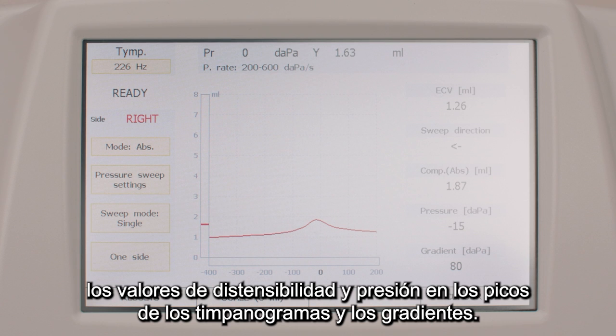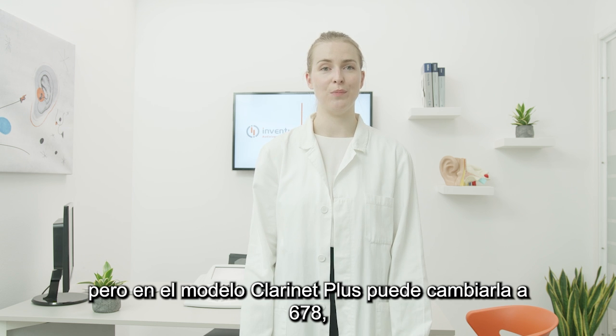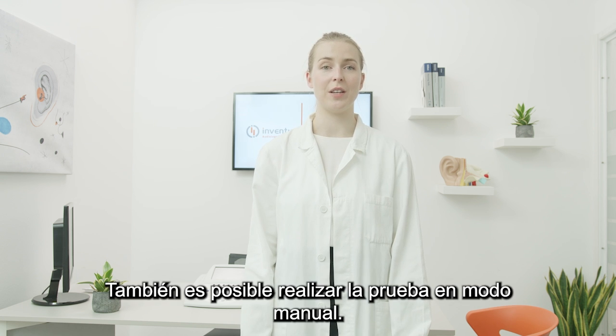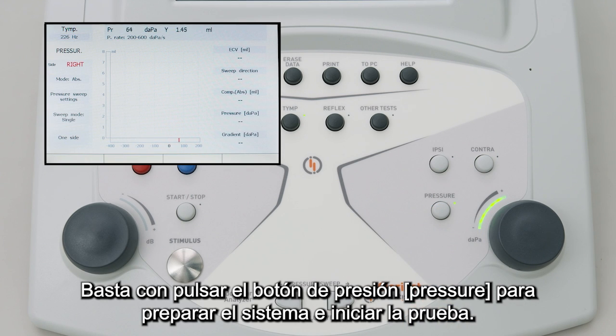The default probe tone frequency is always 226 Hz, but on the Clarinet Plus model, you can switch it to 678, 800 or 1000 Hz. It's also possible to conduct the test in manual mode. Simply press the pressure button to prime the system and start the test.